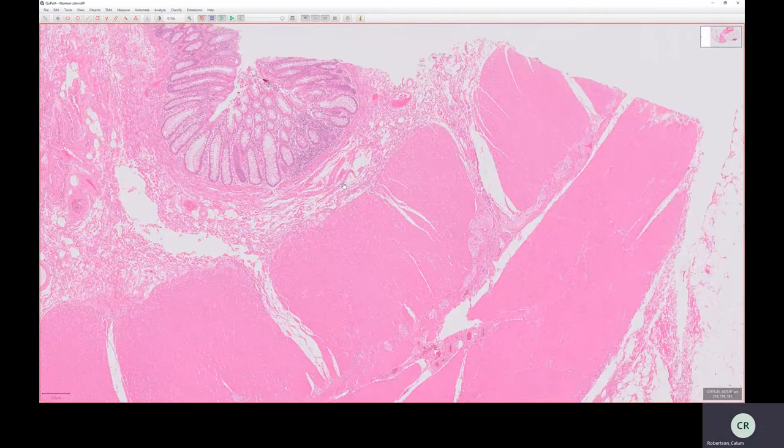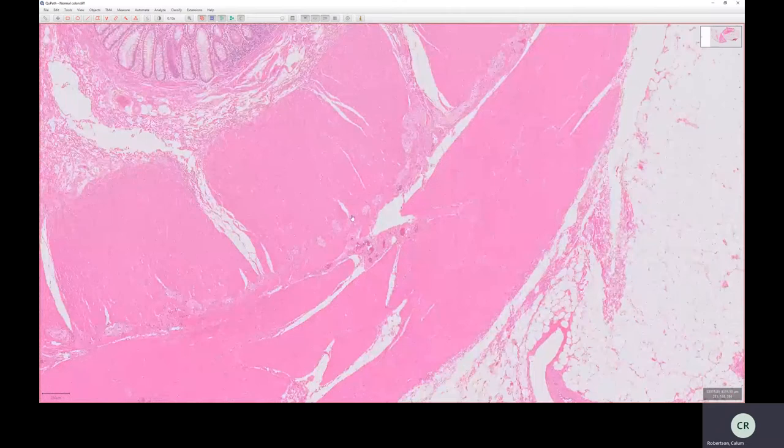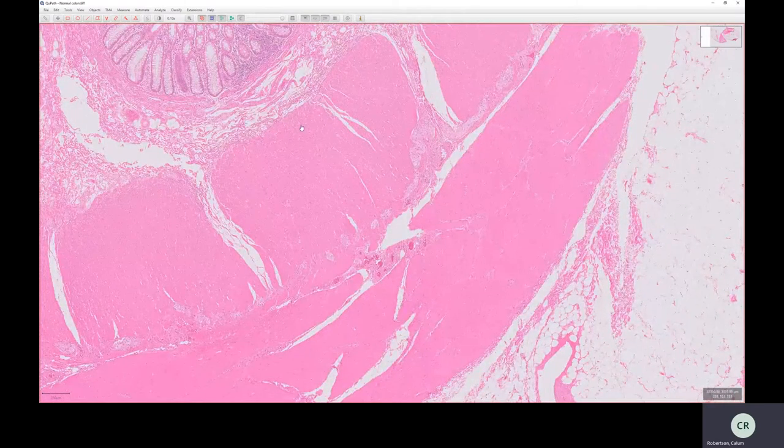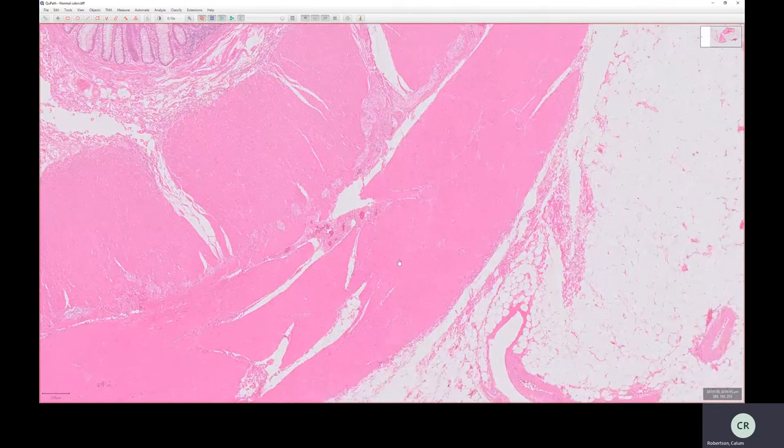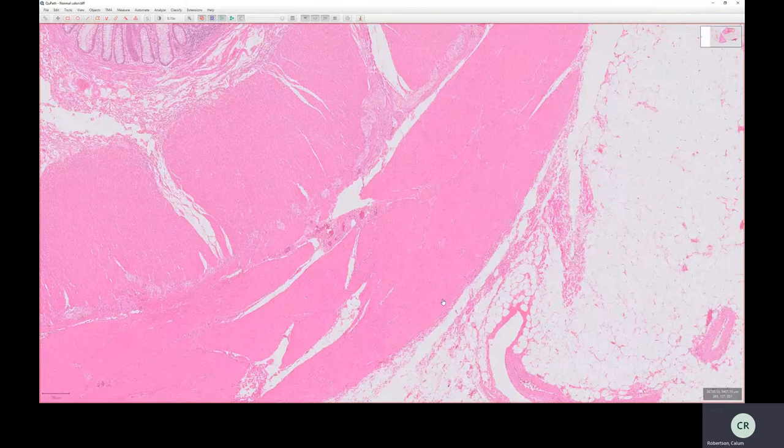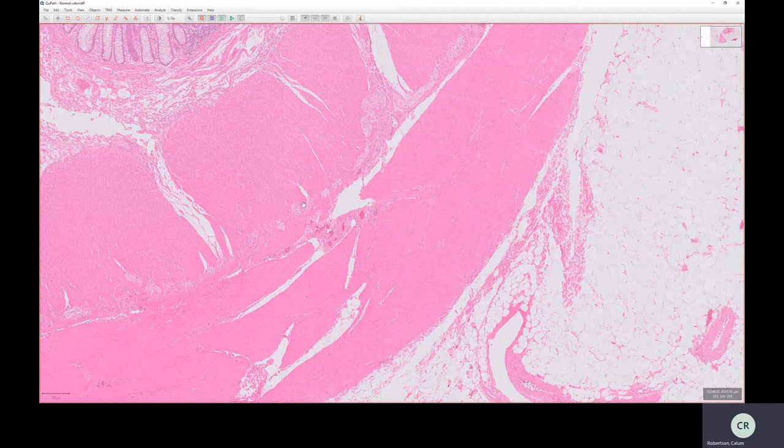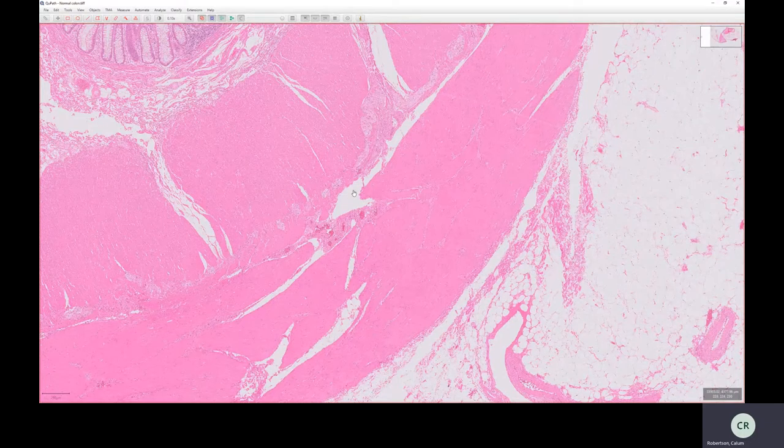Underlying that, we've got a layer which is very similar to this muscularis mucosa, because it's a muscular layer, but it's much thicker, and it's called the muscularis propria. The muscularis propria is made of two main layers here.